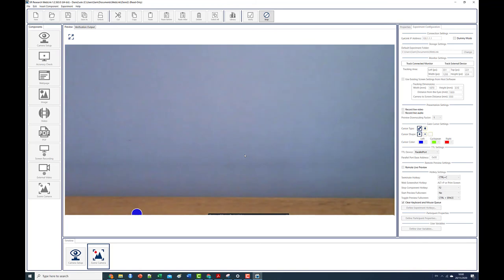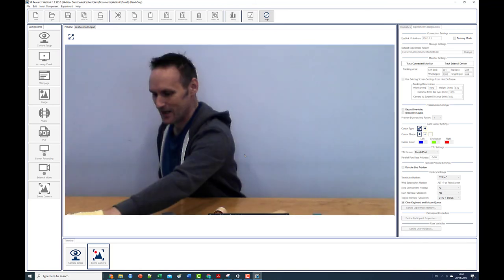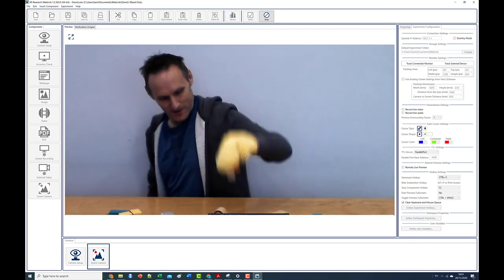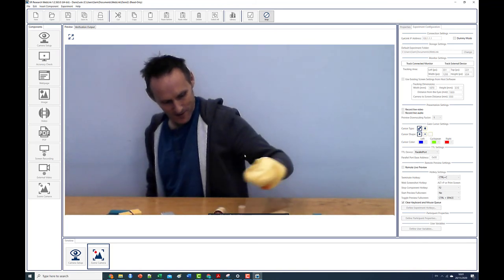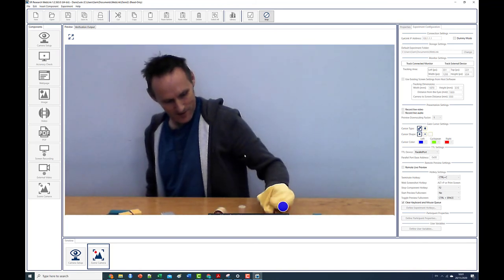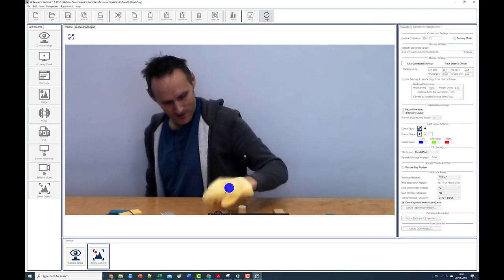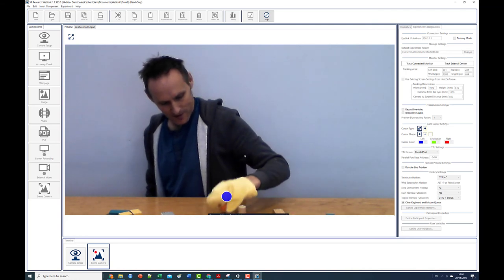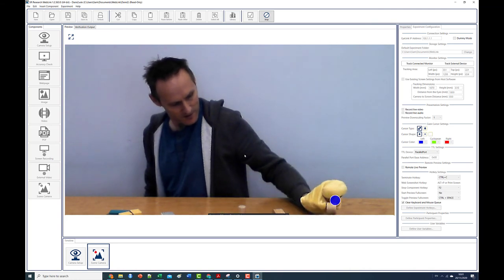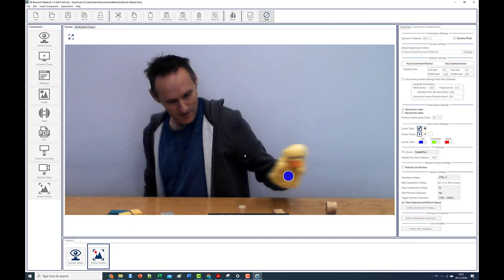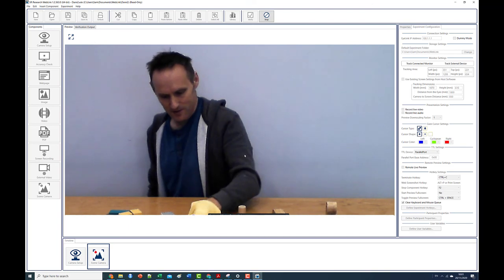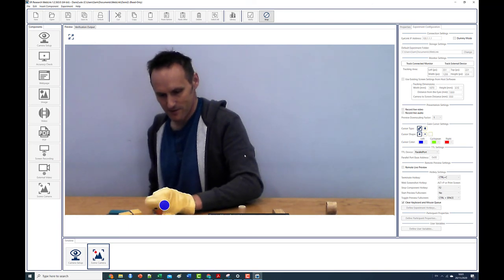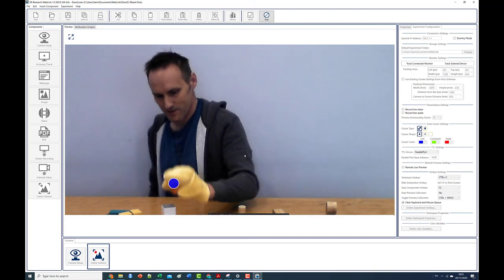During recording the preview panel will show the video feed from the scene camera as well as the calibrated gaze cursor. When you are done press F2 and the data will be saved.